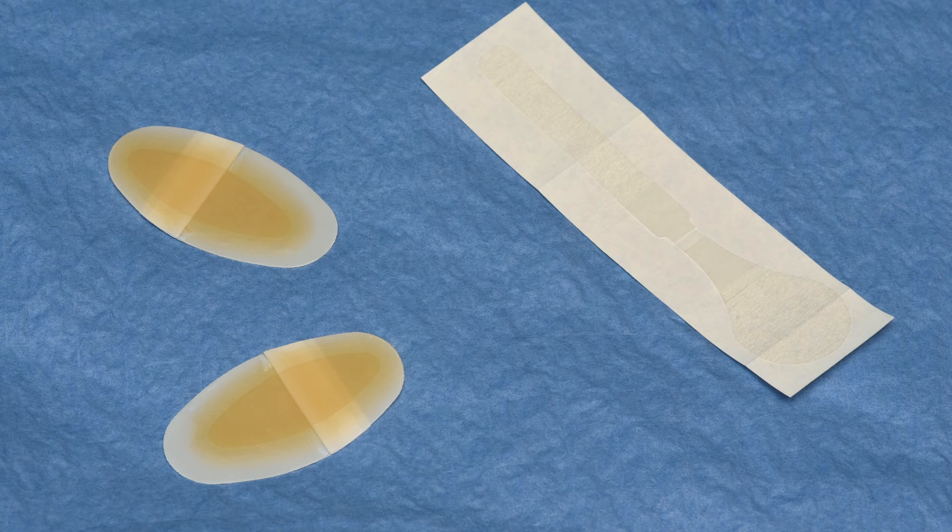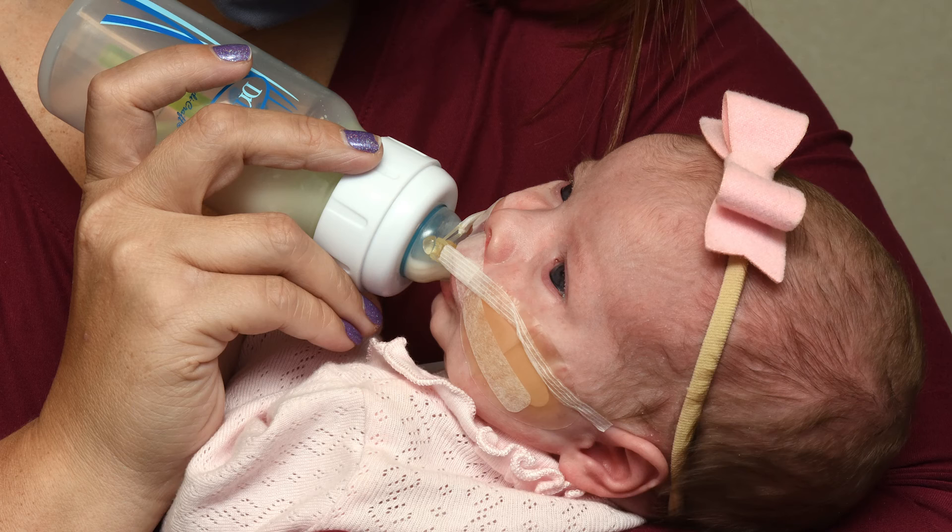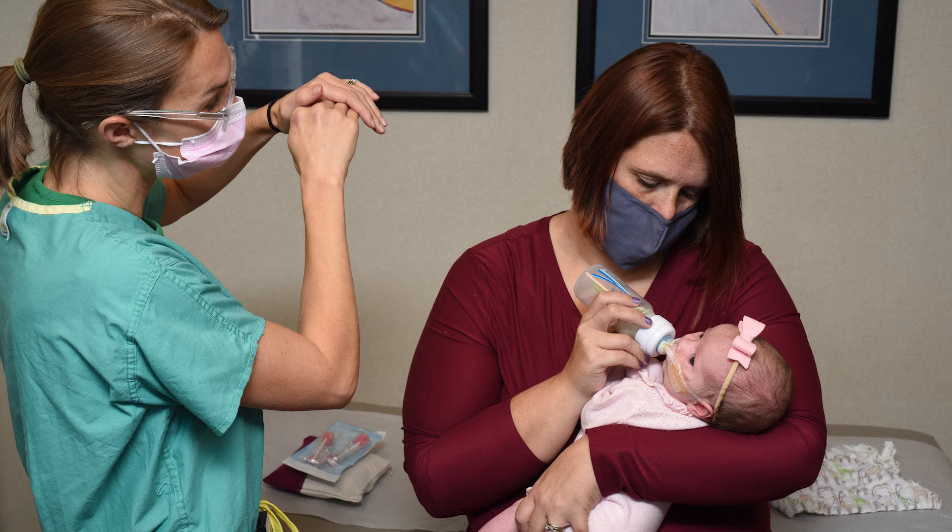Nasal and lip taping helps to improve the soft tissue relationship and adds to the symmetry before surgery as well, and these work together with the NAM. Additionally, the acrylic mouthpiece component of the NAM helps to provide an intact surface against which the bottle nipple can rest during feeding, and helps provide a barrier between your baby's mouth and the more delicate types of tissues inside the nose.